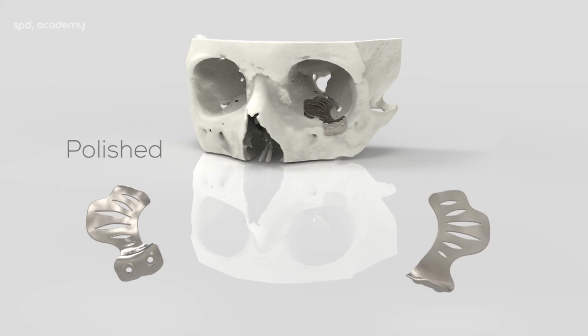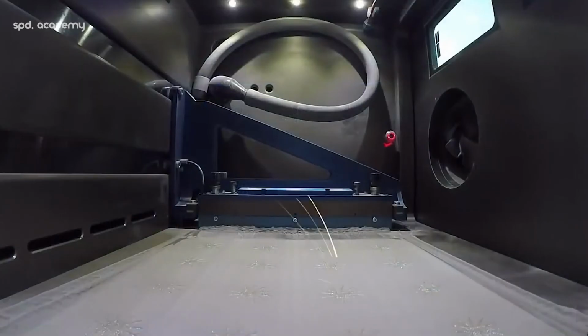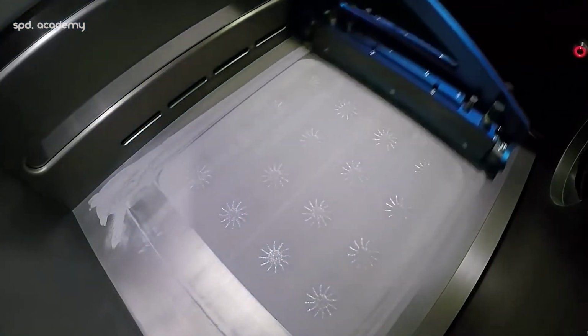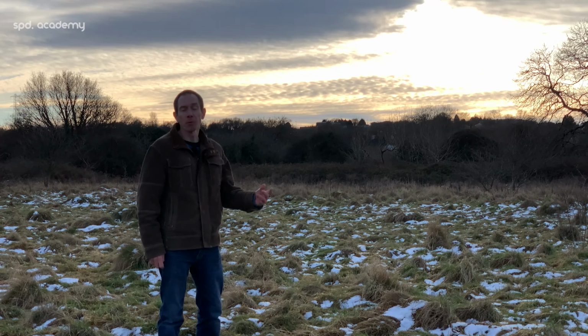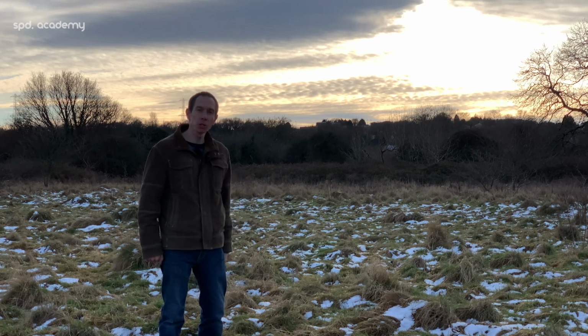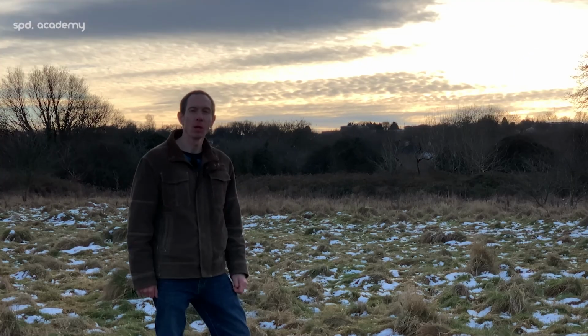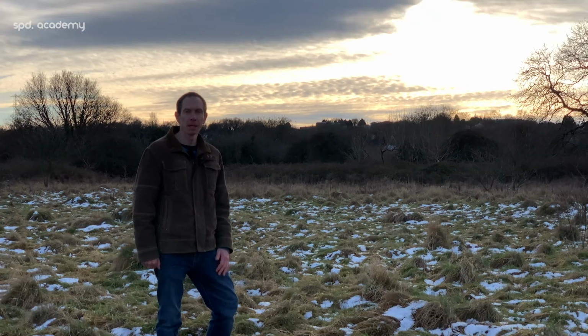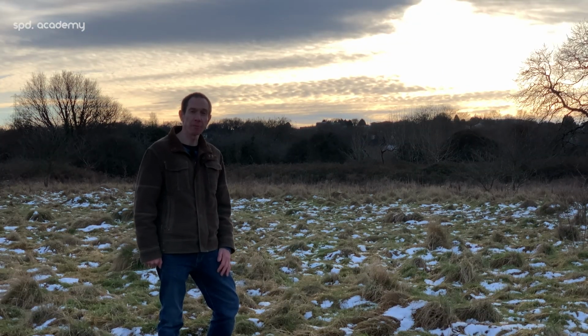A polished surface in contact with the eyeball is typically desired, whereas the bone contacting side can be left rougher. Confirm your finishing requirements to the manufacturer. They may need to add a thickness to the design to account for the polishing process removing material. From thresholding correctly to using the uninjured orbital floor as a template, we can create a patient-specific, single-use, onlay implant to help restore the positioning and function of the eye.